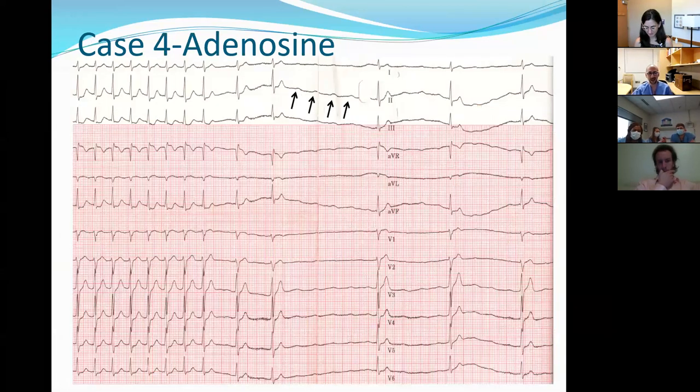All right. So we gave adenosine for this patient, and the number one thing is if you are going to do adenosine, absolutely please make sure that they are on similar sort of telemetry, or even more preferably that you are running a 12 lead with the rhythm strip going while you're giving the adenosine. I won't believe anything you tell me about what happened unless I can see it myself. So either have a 12 lead of it, or have the telemetry going in some way and make sure it's saved. Like if they're in the ER, make sure they're printing paper out in some way so that we can see it at a later time.